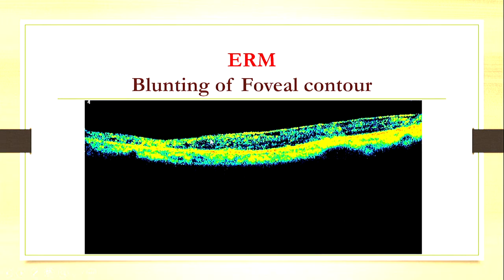This is an epiretinal membrane here. You see this line on the surface? This is the retinal surface. You see the membrane, and you see the foveal contour is blunted. So this is an epiretinal membrane. Some blunting of the foveal contour is there. It could cause some visual effects.